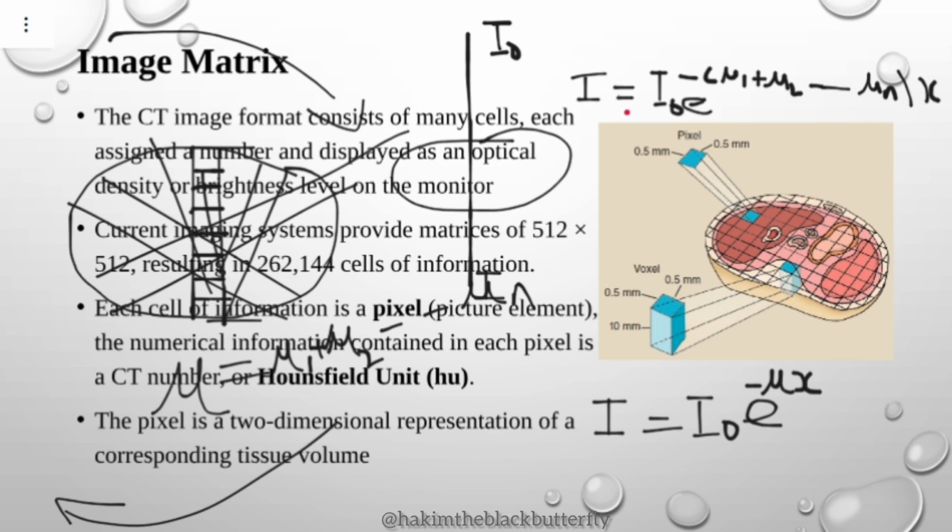And all these equations must be calculated by a CT. The CT can get a volume of data that it has to calculate in the end. These are just simple equations which I have shown you. But actually, these equations can be solved by what we call fast Fourier transform equations.